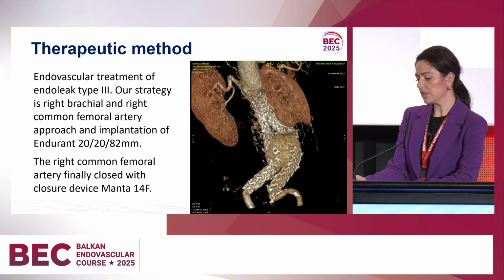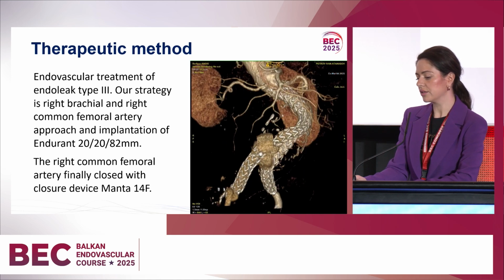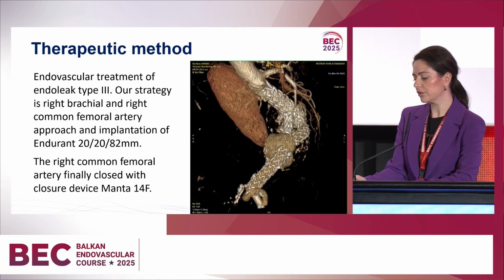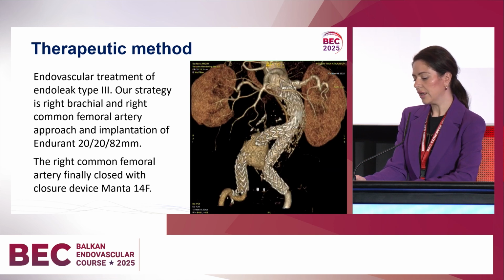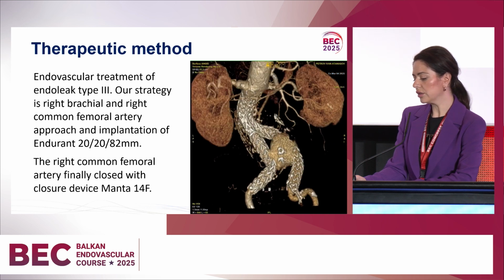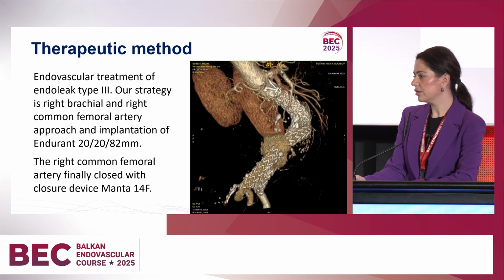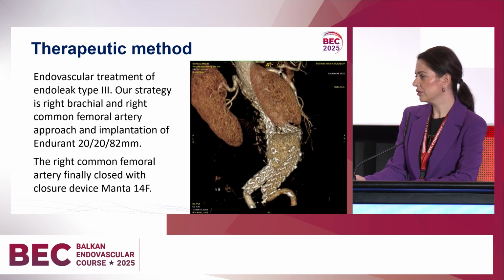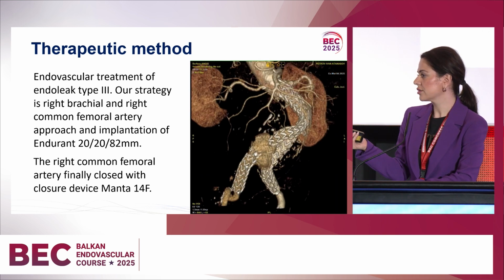Our strategy is a right brachial and right common femoral artery approach and implantation of an Endurant stent graft. The right common femoral artery will finally be closed with a closure device, Manta 14 French. Maybe Professor Petrov can comment on this, the next live case.